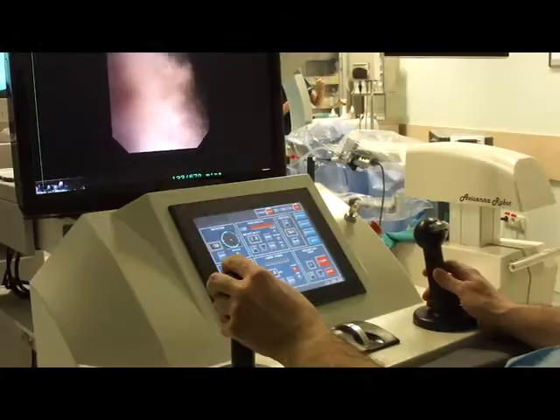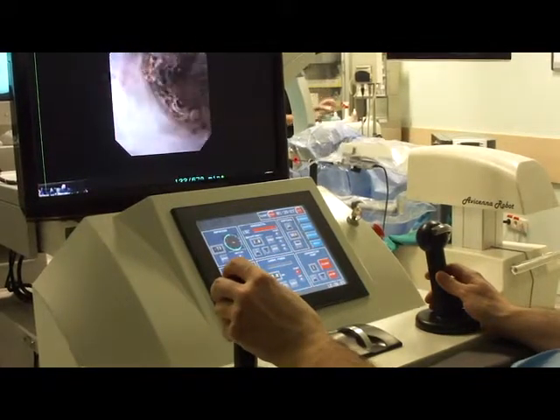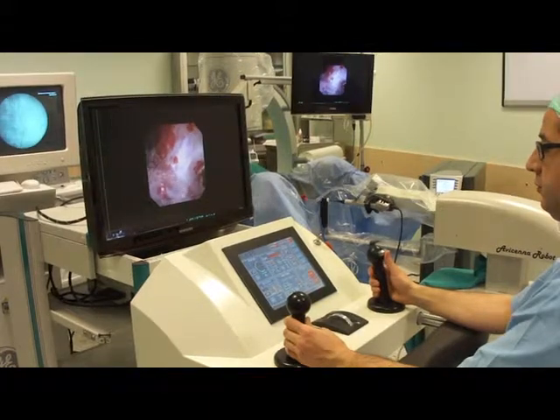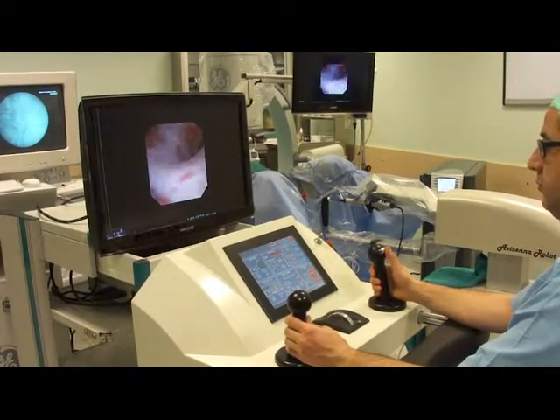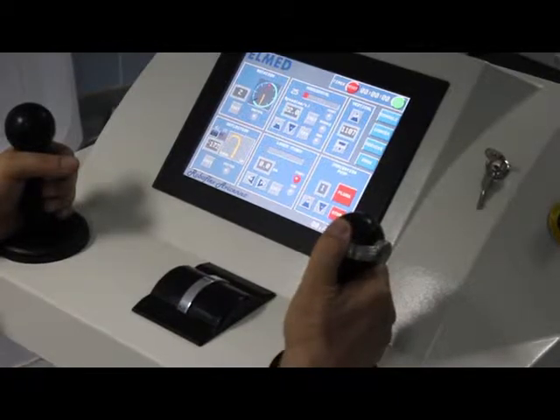The position of the ergonomic chair, armrest, and control panel can be individually adjusted and stored in the system for up to six users. To manipulate the endoscope, the surgeon controls two joysticks. The right one enables deflection and is designed similarly to the handpiece of any standard flexible ureteroscope.